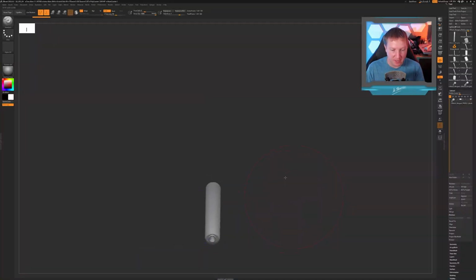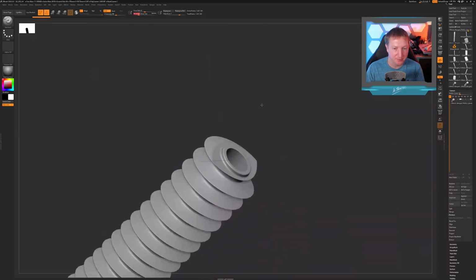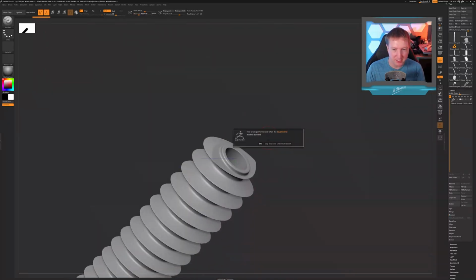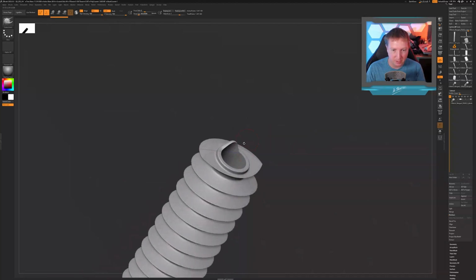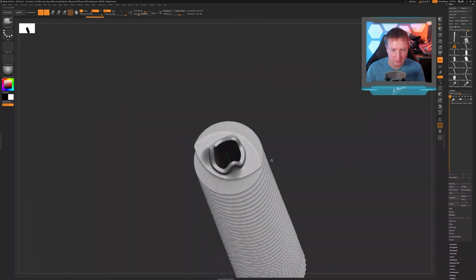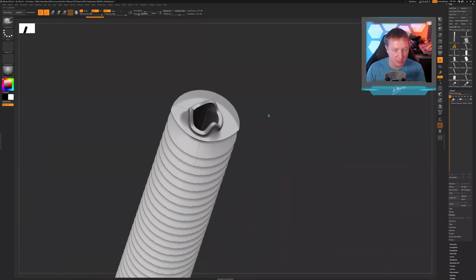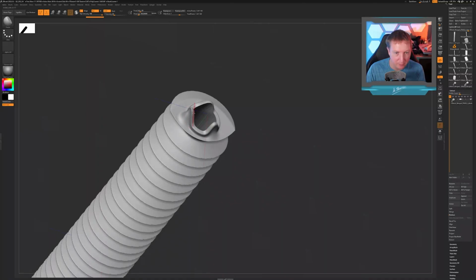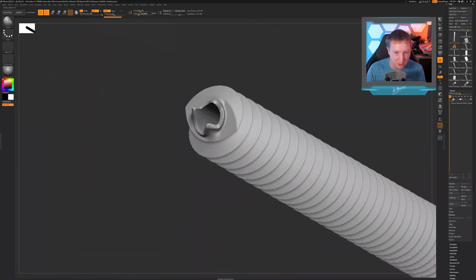Oh yeah, and one thing I forgot to add here was the self-tapping drill bit tips. So let's come down here and drag some of those out. Let's just pull this out here. I'm not really sure how they do these. I think they have 3 of them. Okay, so that looks roughly symmetric. No one's going to be looking at it as big as we're looking at it right now, so it doesn't really matter if it's perfect. I'm just going to file down the edges of these here to make them a little bit sharper.